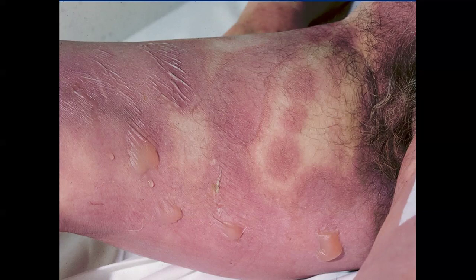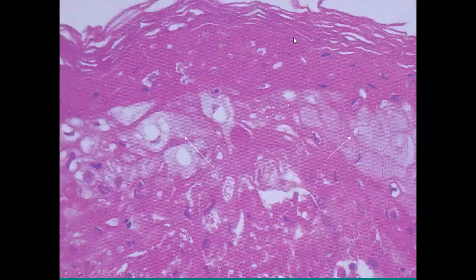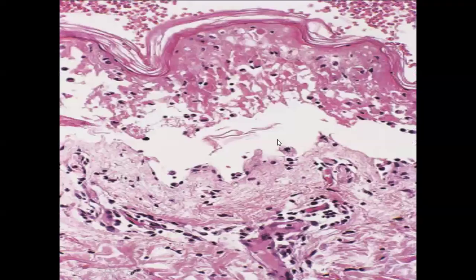This is usually a drug reaction in which suddenly you develop epidermal necrosis, and soon after, this epidermis peels off, leaving raw eroded areas. If we take a biopsy at this stage, you would see lots of epidermal necrosis, with no keratinocyte boundaries or cellular definition visible in this histopathological appearance.